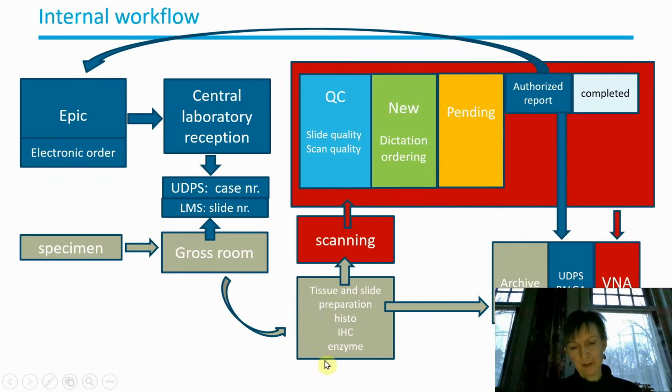After the stains are made, the slides are made, they are immediately scanned and then recorded in our image management system.